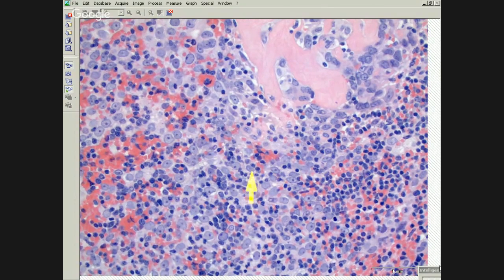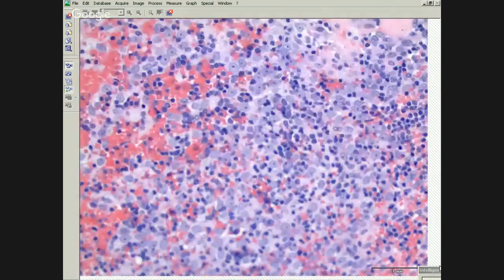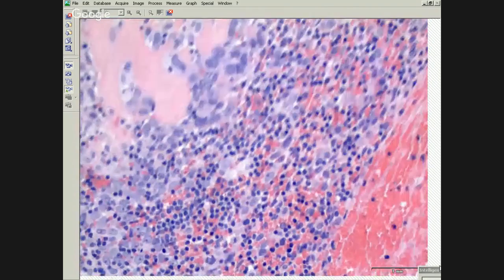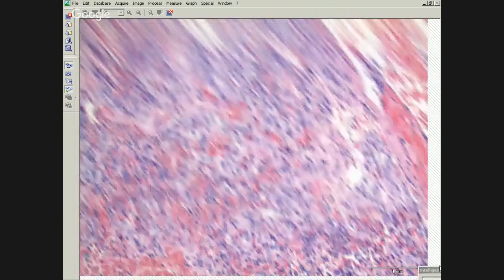But again, pleural biopsy, you want to get a keratin. So all these cells are going to be keratin positive. So you've got keratin positive cells, meso markers negative, lymphocytes in the background. And sometimes they will retain the big fibrous bands and the lobular architecture of thymoma as well. But that's what this is. So this is drop metastases of thymoma to the pleura.